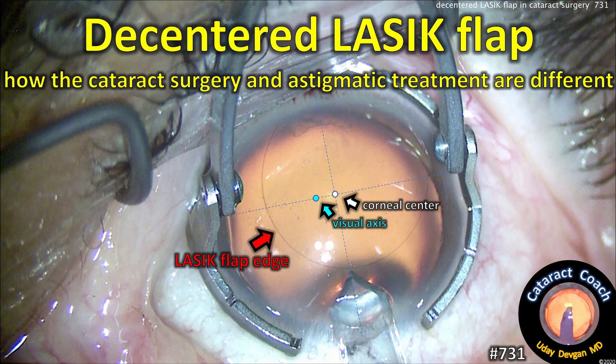CataractCoach.com. De-centered LASIK flap: how the cataract surgery and astigmatic treatment are different now.